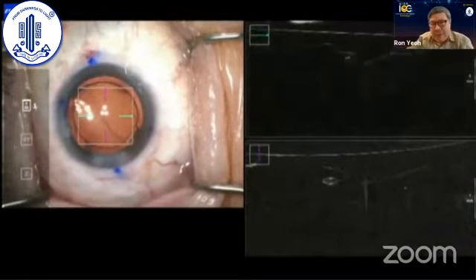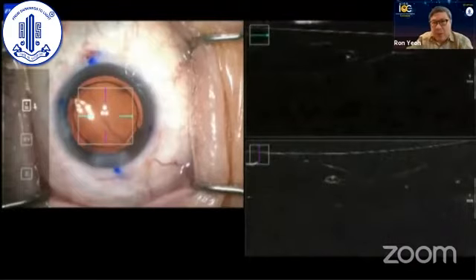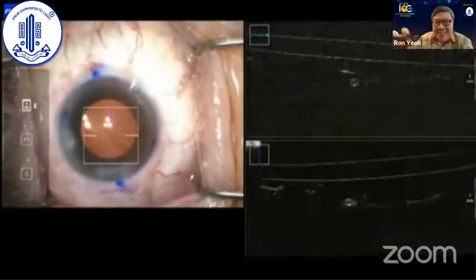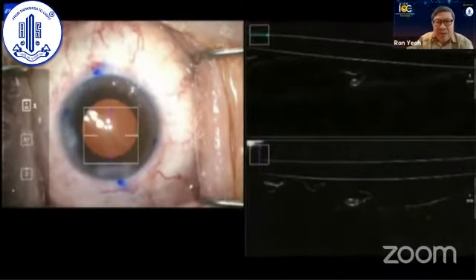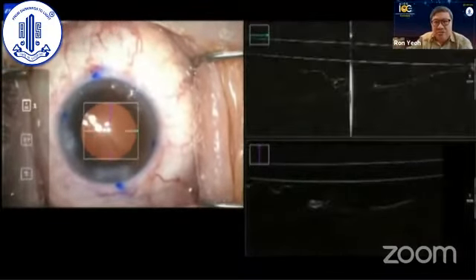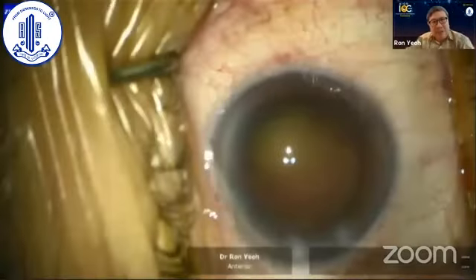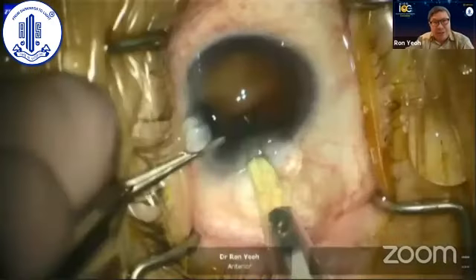Okay, and if you notice what I showed you just now with the anterior capsule, because you've got a nice round anterior capsular CCC that's intact, the edge doesn't roll. The edge is actually completely straight. But when you've torn the posterior capsule, you get this scroll-like image. Having got that one, shortly after that, here's another one.